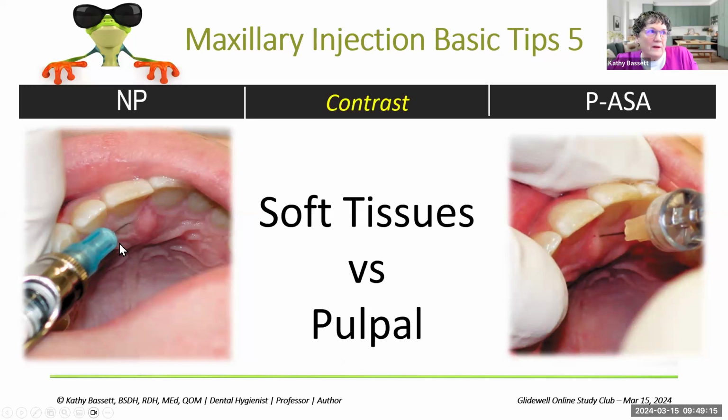And so rather than entering from the side, 45 degrees, make contact with the bone, we insert more anteriorly, and we intentionally travel into that foramen a little bit further. And they have documented that administering here allows you to actually capture that whole anterior segment. So you can end up getting pulpal, lingual, and facial gingiva anesthetized with this injection, and it will not impact the labial tissues.